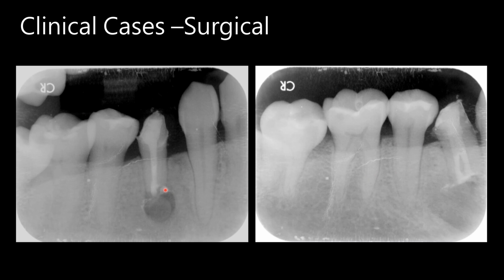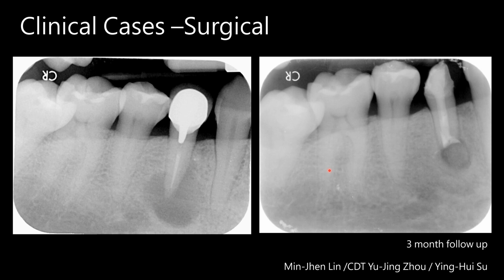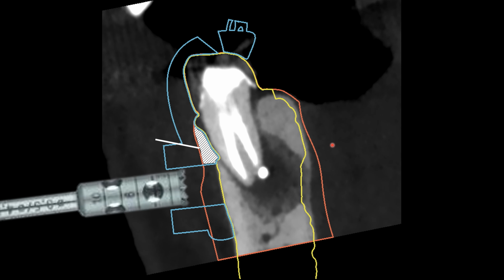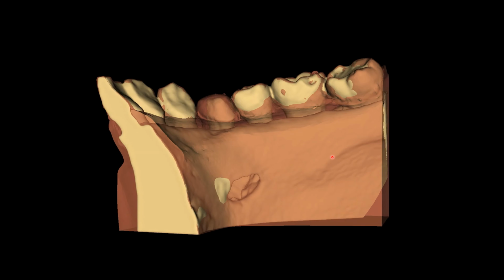And here is the post-op, and we have a 2 years follow-up. As you can see, the lesion is healed, and we put a new crown on it. So here is the full design of the surgical guide.